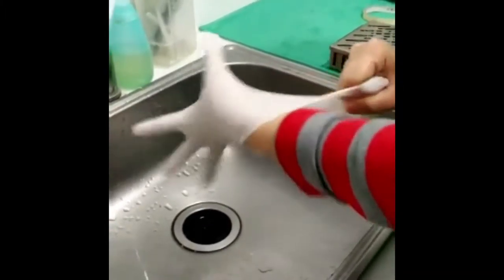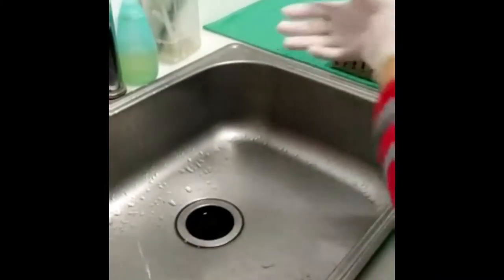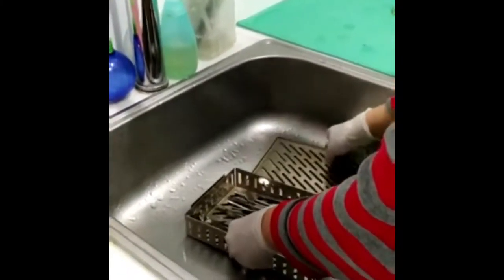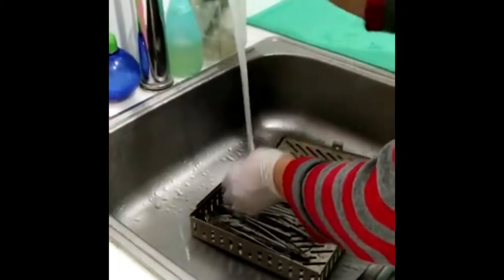Hello everyone, today I'm going to show you the process of sterilization. Before any clinical process, remember to wear gloves to avoid any kind of transmitting infection.